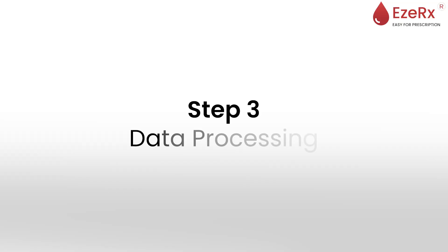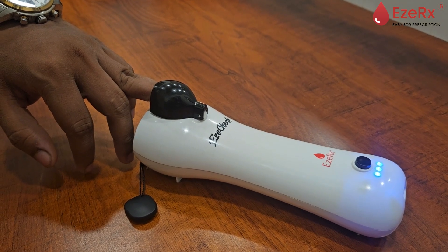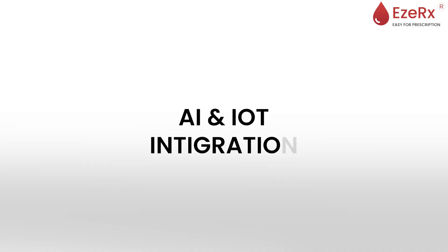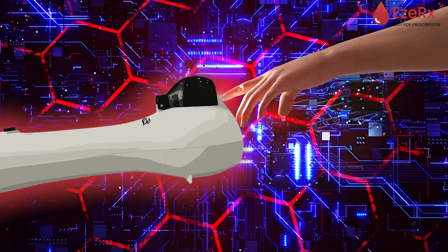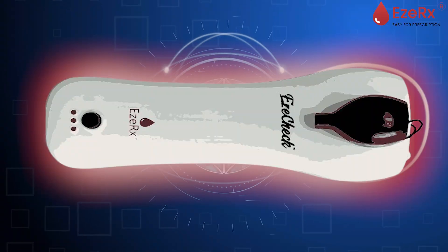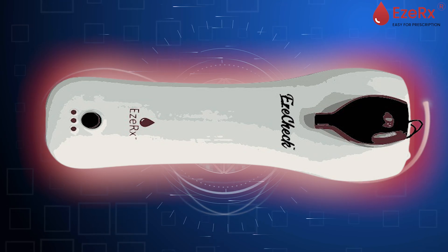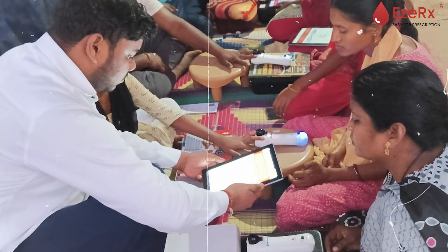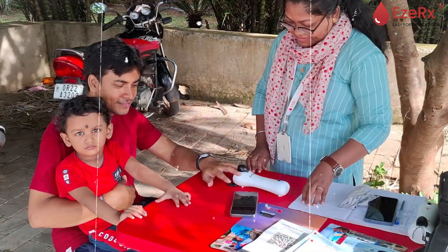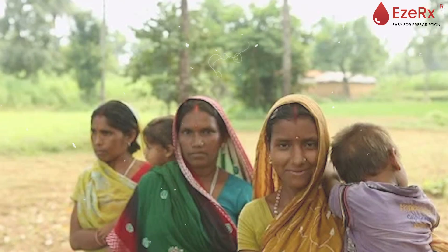Step 3: Data Processing. Once the data is collected, the real magic begins. EasyCheck's powerful AI and IoT integration work together to analyze the data in real time. The signals captured by the device are processed instantly using advanced algorithms, ensuring highly accurate hemoglobin readings. This technology ensures consistency regardless of where the device is used — be it in a hospital, a clinic, or a remote village.